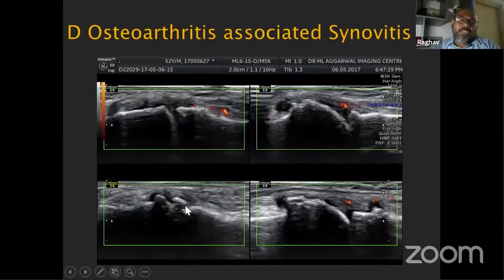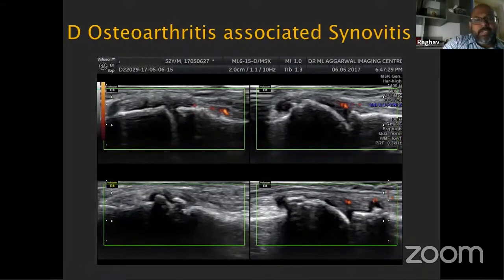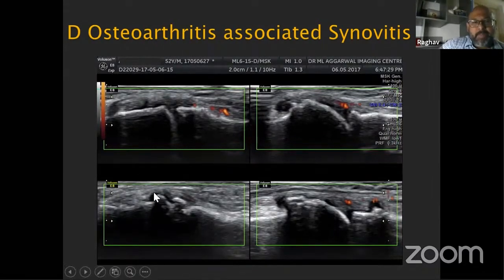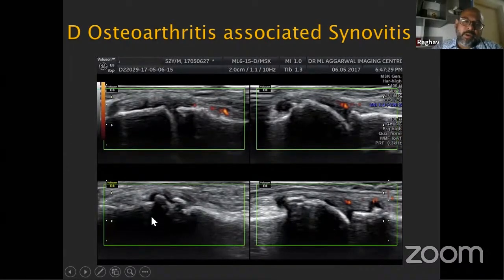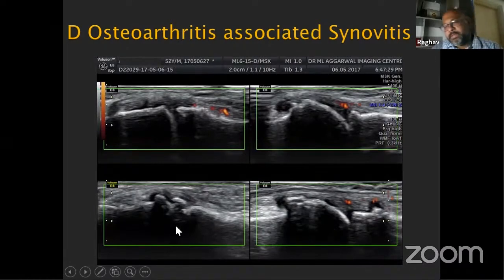findings. And again, osteoarthritis. Here you can see in osteoarthritis, we have these step up artifacts. We have a step up artifact here. In inflammatory arthritis, we have the erosion step down artifacts, and a fracture will be a step off artifact. So when we are looking at a structure, maybe a secondary osteoarthritis in a joint, with osteophyte formations and joint space loss, we know that we are dealing with a degenerative joint.